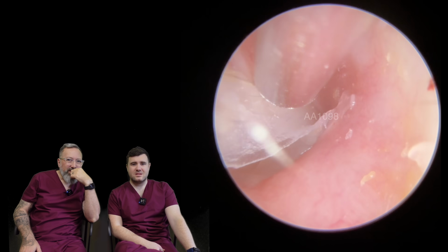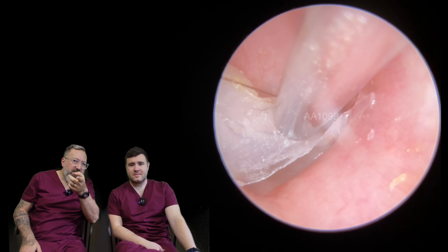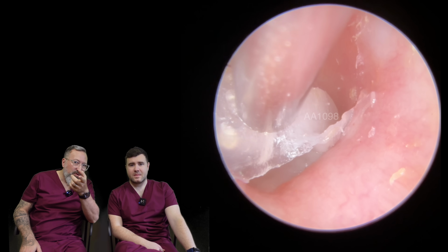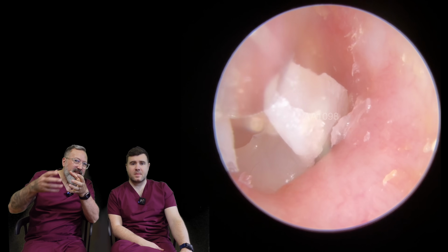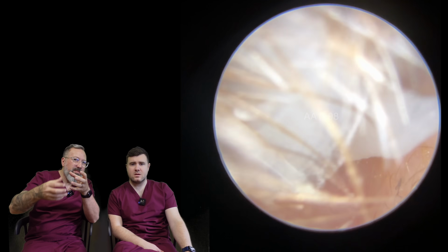Cool. I know. That is stuck, isn't it? So I've gone in now. We were starting off with the fine end just to peel it away, but now I've got the standard size on to give it a bit more of a suction grip. But look at that coming off. Luckily with the silicone, it kind of warmed up inside the ear, so it's made it a bit more pliable.